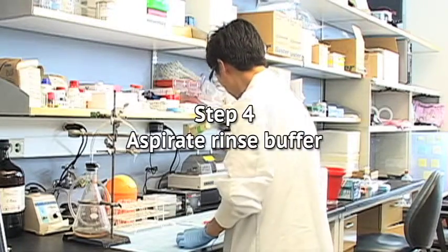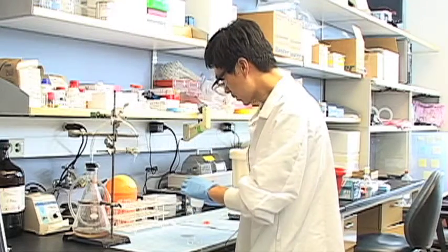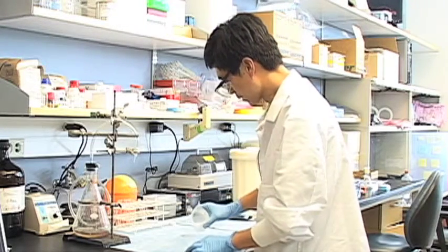Step 4: Aspirate rinse buffer from the plate. Quickly aspirate all rinse buffer from the plate.